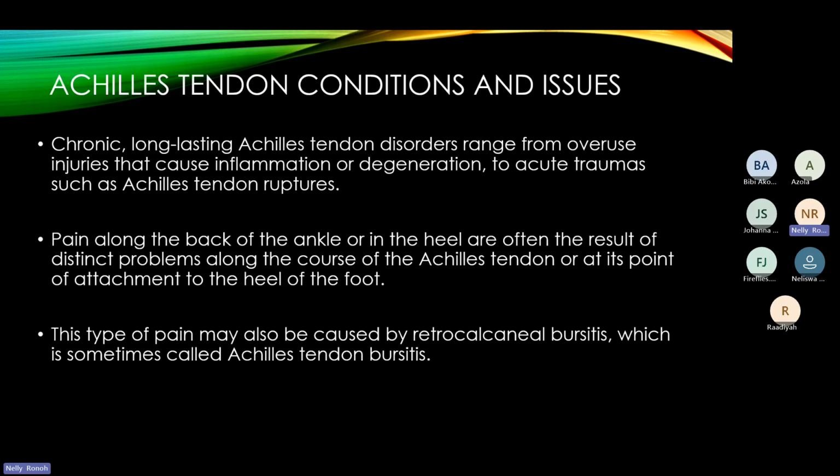So pain along the back of the ankle or at the heel is often a result of distinct problems along the course of the Achilles. This type of pain may also be caused by retrocalcaneal bursitis, which is sometimes called Achilles tendon bursitis. Bursitis, in most cases, would appear as fluid collection at the point of insertion. Like now at the calcaneal attachment, you might see some fluid collection there, and that could be Achilles tendon bursitis.